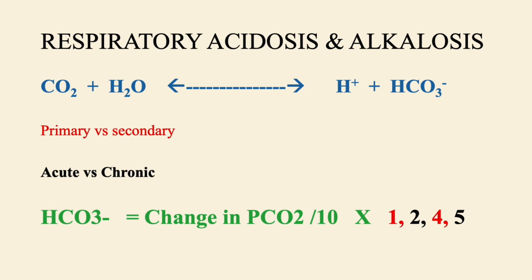If the number in the ABG is showing bicarbonate of, let's say, 18, then this patient has respiratory acidosis and metabolic acidosis. Now, if the number was 25 in the ABG, that means properly compensating. If the number was 28, then it's more than 25. That means the patient has additional metabolic alkalosis. And that's how you go about respiratory acidosis.